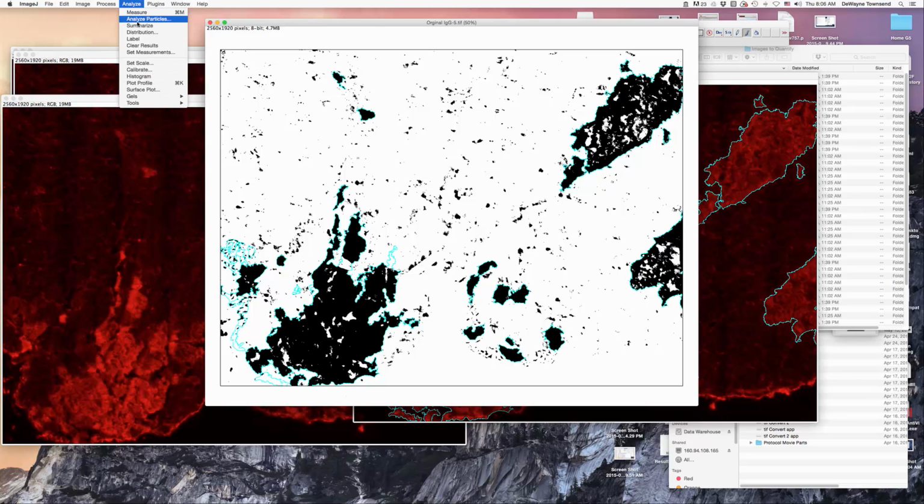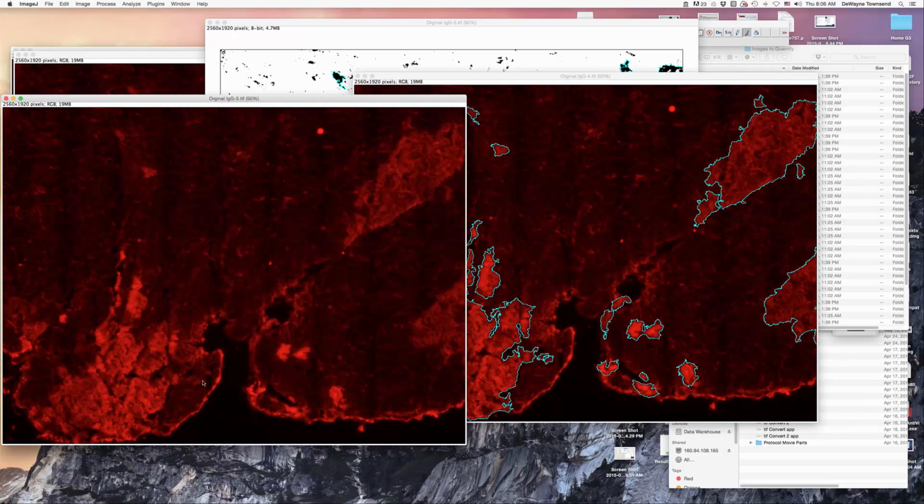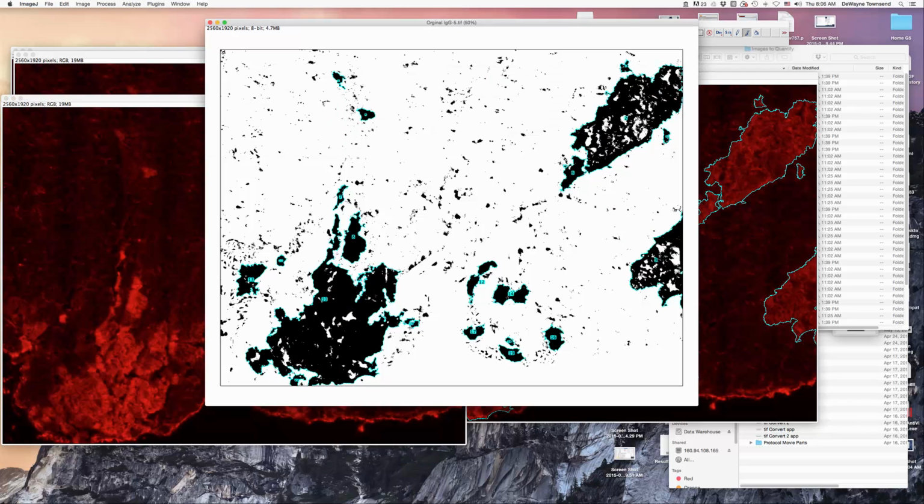Let's see how we're doing. Analyze. Okay, come back to this image. Okay. Alright, so this looks pretty good out here. When we look over at the lesions, the unlabeled lesions, we can kind of appreciate that. There's this little stuff over here. We've got to decide. I'm going to say that's negative. So this is negative, and that's great.